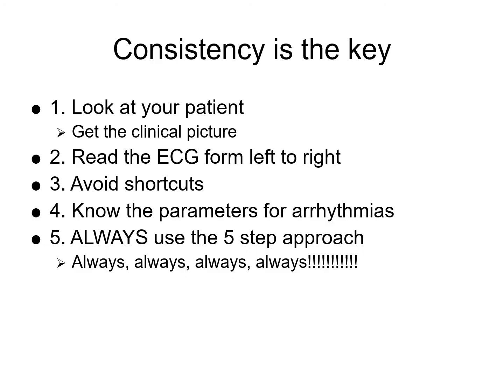All right. Consistency is definitely key when you're looking at an EKG. You obviously want to look at your patient, get the clinical picture, see what's going on with them. A little background information is always helpful. Remember that we're treating the patient, not the monitor, so don't always believe the monitor immediately. Look at your patient, and make sure there isn't anything disconnected on your leads, or connected up wrong for some reason.